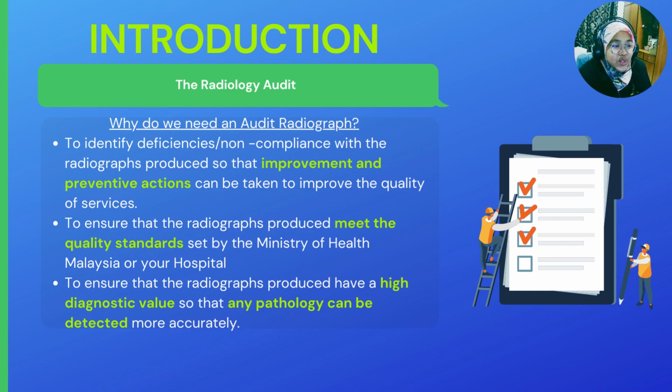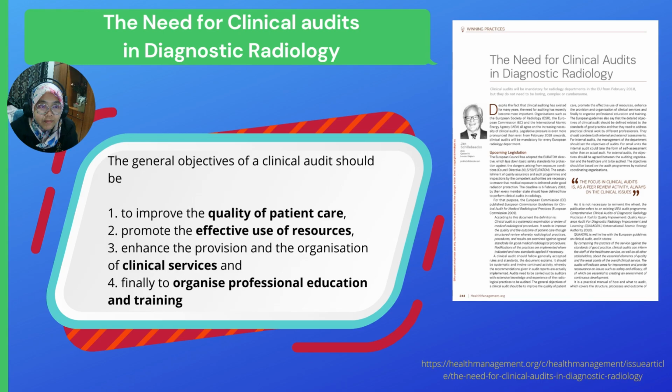And thirdly, to ensure that the radiograph produced have a high diagnostic value so that any pathology can be detected more accurately. So the point is here, improvement and prevention actions, meet the quality standard and have a high diagnostic value so that any pathology can be seen in your radiograph. Okay, this is why the radiology need audit.